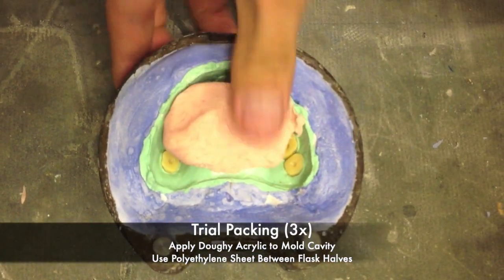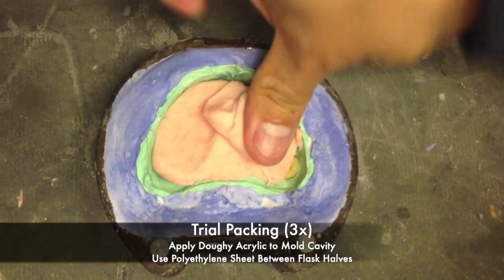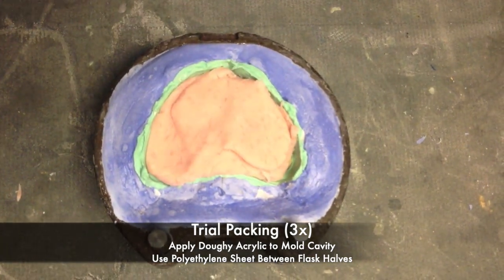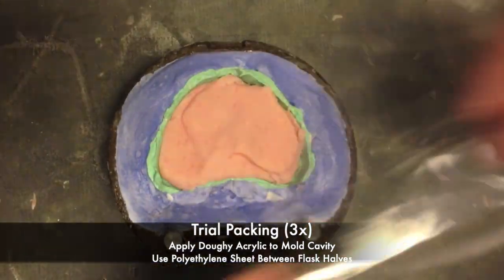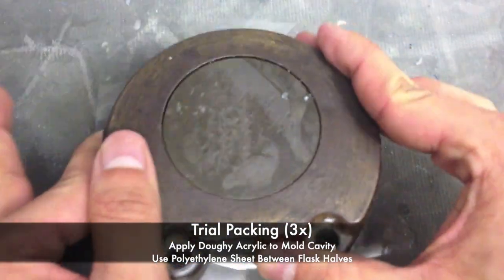Remember that according to the Air Force, you should perform three trial packs. You're going to apply the doughy acrylic into the mold cavity and use the polyethylene sheet between the flask halves. This will allow you to reopen the flasks after each trial pack.